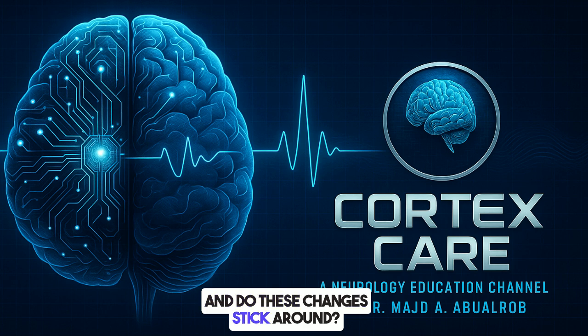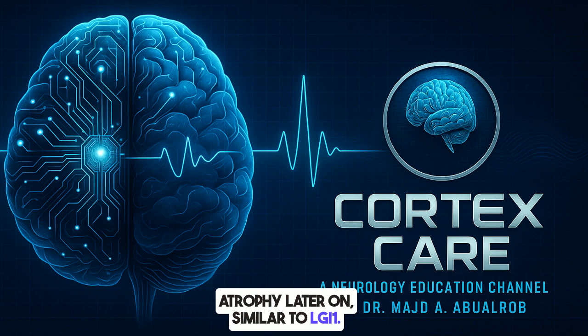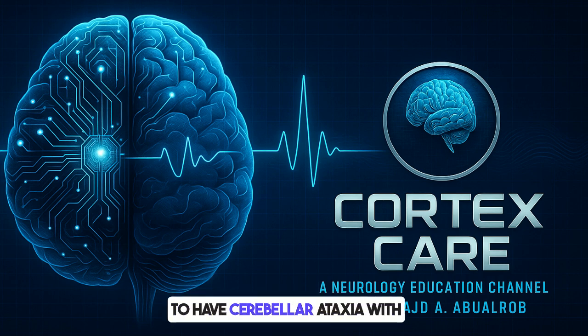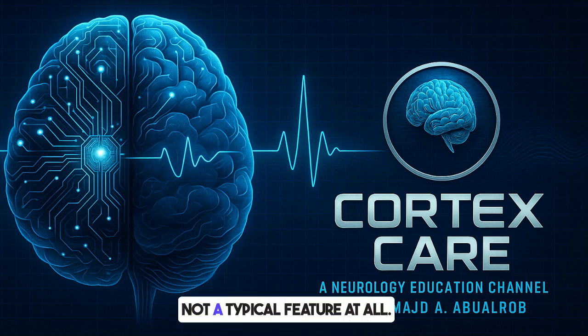And do these changes stick around? They can evolve into hippocampal atrophy later on, similar to LGI1. And if a patient happens to have cerebellar ataxia with CASPR2, you might see cerebellar atrophy on follow-up scans. Okay. Do the initial bright spots usually fade? In most cases, yes. Those acute signal changes tend to normalize over time. And contrast enhancement in CASPR2? Rare. Very rare. Really just single case reports mentioning some enhancement in the basal ganglia or medial temporal lobes. Not a typical feature at all.